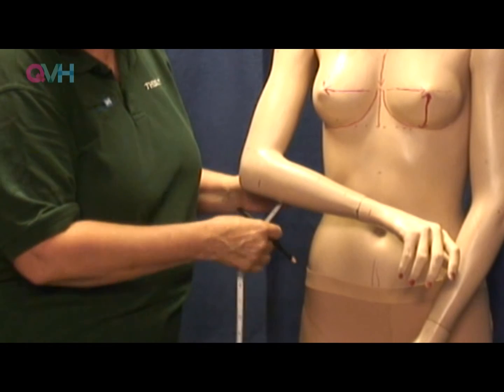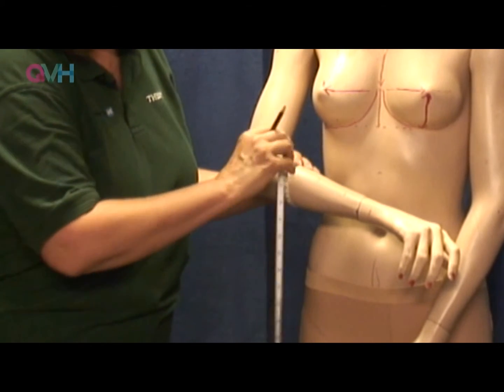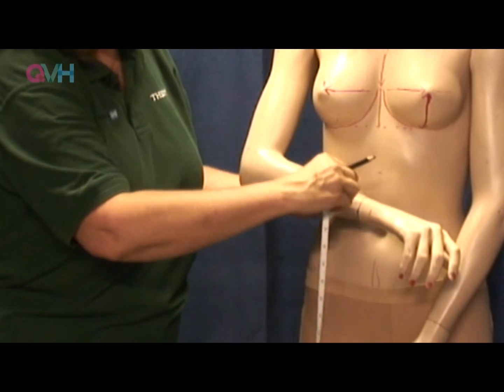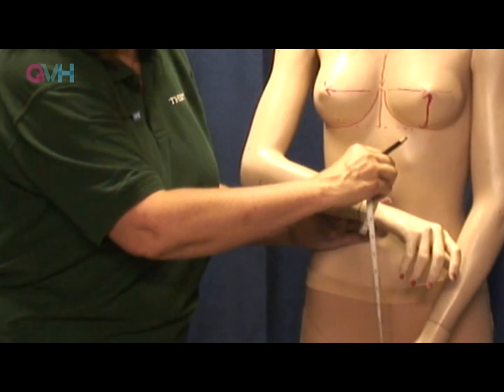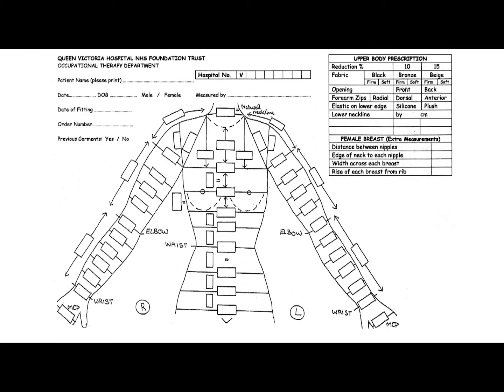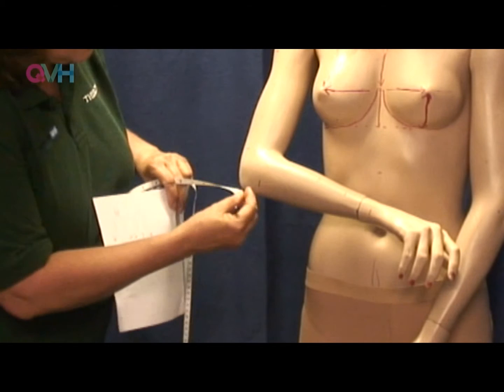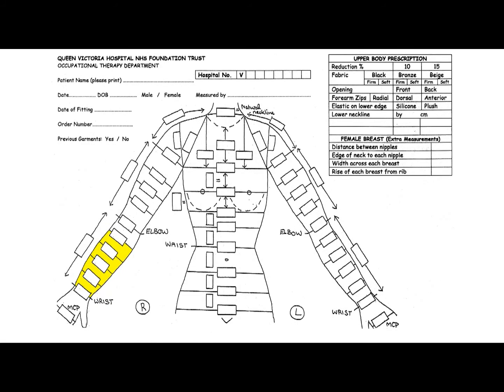And then whichever direction we're now heading, if I keep heading down the arm, I would measure each of those, as you can see, and I would record that I had got 5, 5, 5, 5, and then of course I've got this distance, which conveniently is another 5.